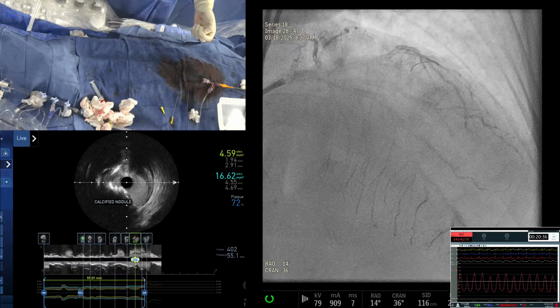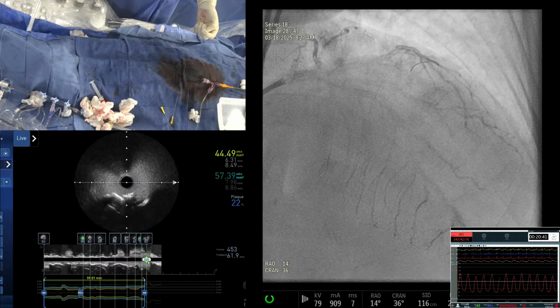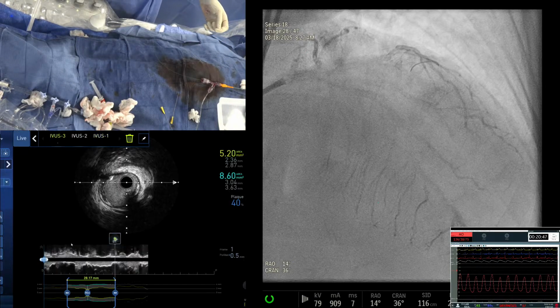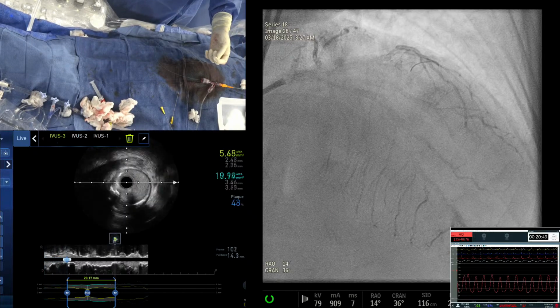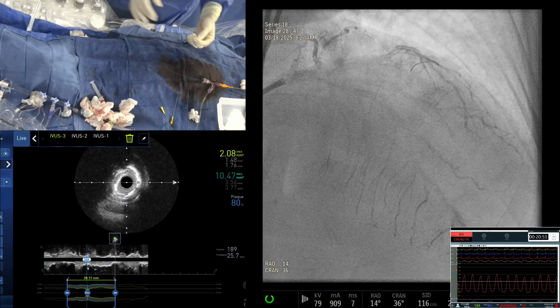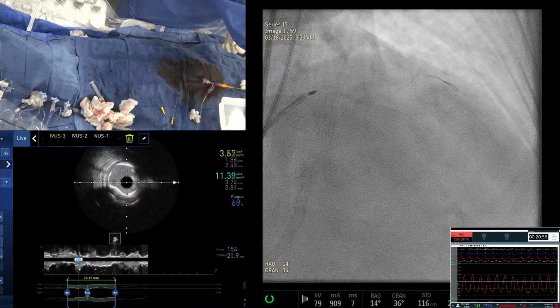So you're saying, based on that, you have to go mini crush, but then the body of the ramus is not fully expanded. What is that? Cutting balloon, 3.5? Oh no, it's too big for the diag. No, we can go 3.0.